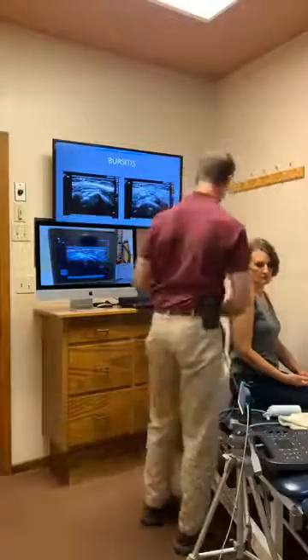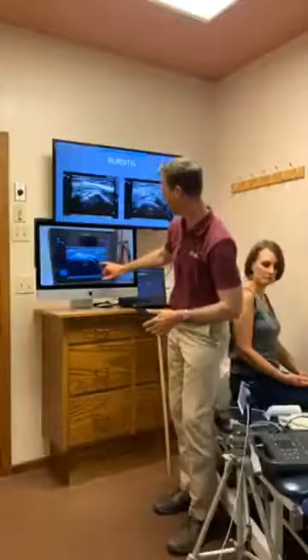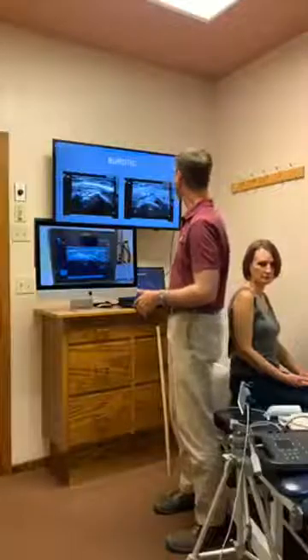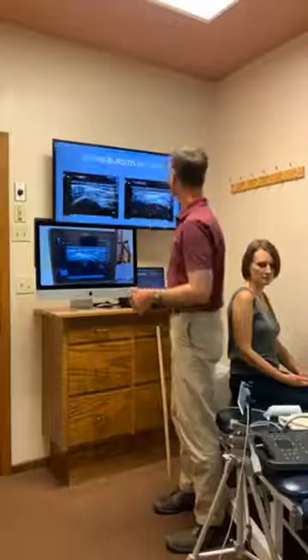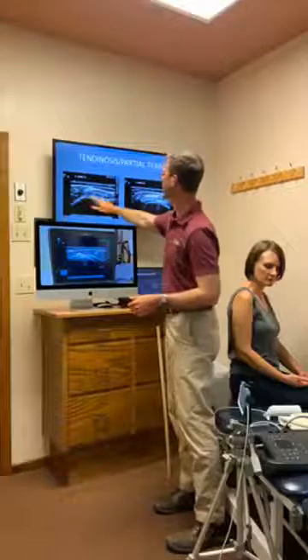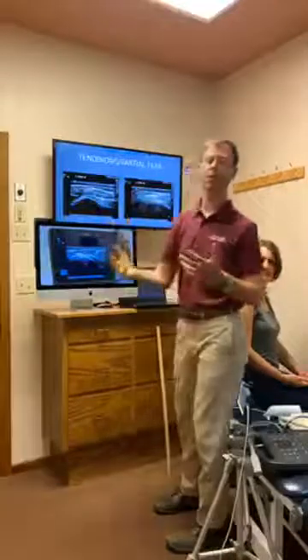All right, this is a long axis view. Tendons on your shoulder blade coming around, then attaching right over here. So you can see, here we are, tendon coming over. It's nice, bright and white. It looks pretty. All right, so then we are going to look right up here, okay? So here's the long axis view, and you can see the tendon, but we have some hypoechoic area here. Again, we have some tendinosis and or partial tearing.